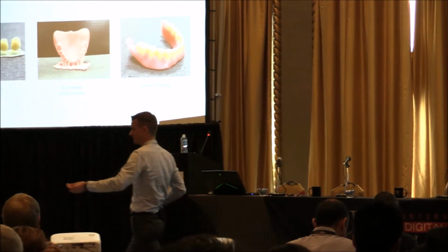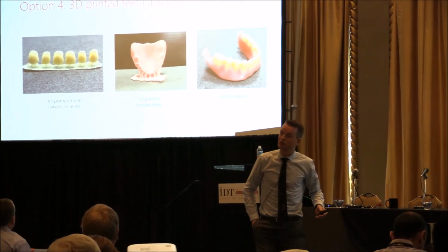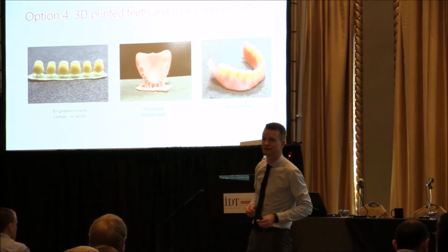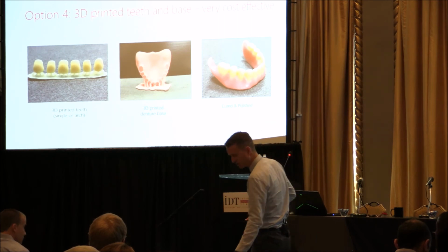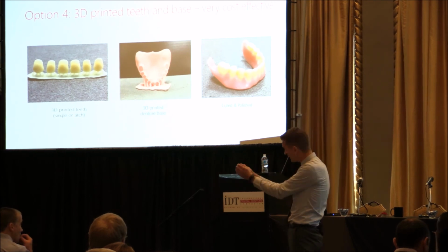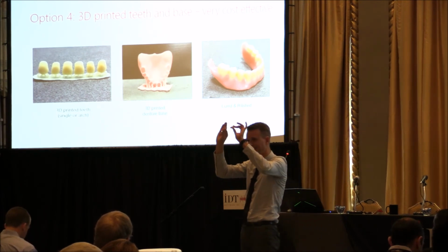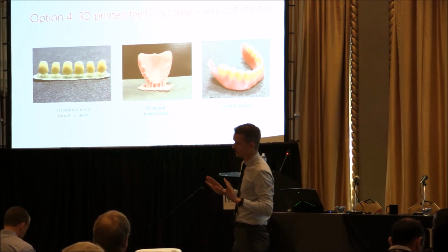Okay? Here we go. Okay, so a little inspired by Dr. Cooper. I prefer the denture queen because I want to be a denture prince. So I was this morning throwing a little bit around with my printed dentures up in my room. I didn't have any hammers or anything. So I was giving in a little bit. So eventually, I managed to break it. Because I was doing it hard like this, don't do that on my denture, because it's my last printed denture right now. So you can break it. It is possible to break at least these ones here by pressing hard. I know I'm a strong guy, but I didn't press that hard, I have to say.